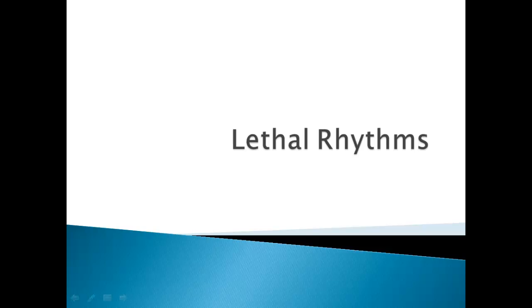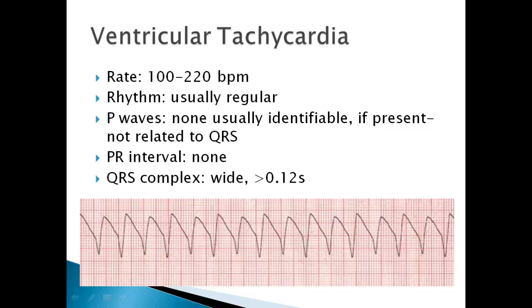This presentation is about lethal or worrisome rhythms that would require immediate medical attention. The first one is ventricular tachycardia.